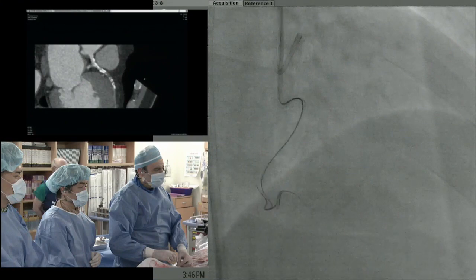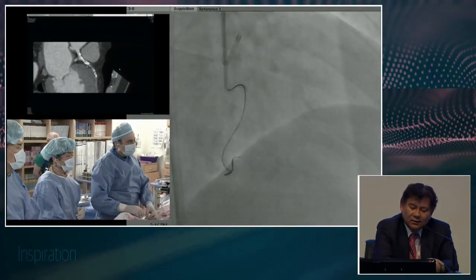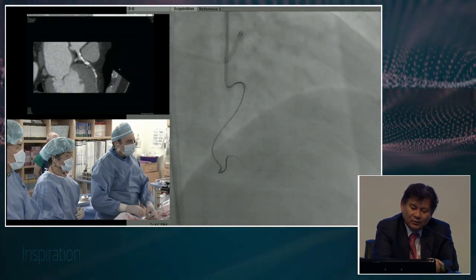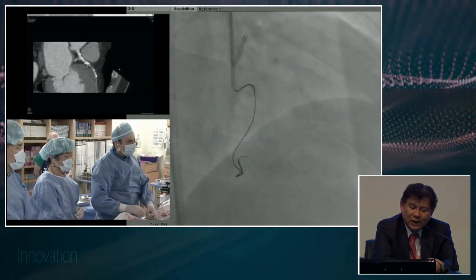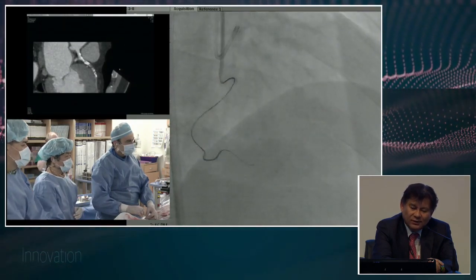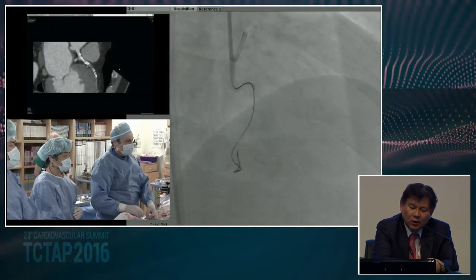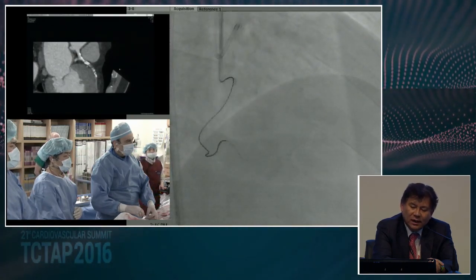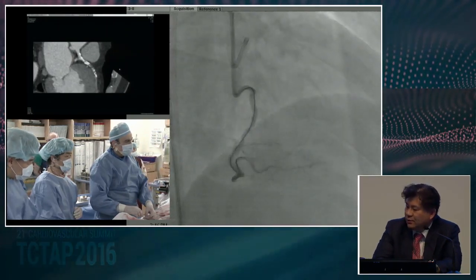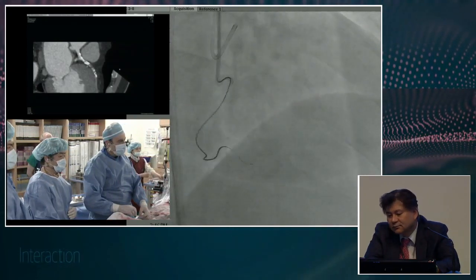Because when we consider the RCA tortuosity and relatively slender channel from the right coronary, most of the operators will try to enter the antegrade option, because there we can see some clearly visible calcification marking along the entire CTO segment and some suspicious stump area in the D1 bifurcation. How about Dr. Wu? I don't disagree with any of these comments.